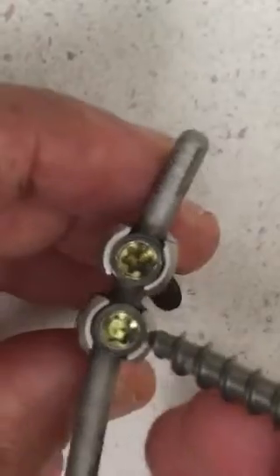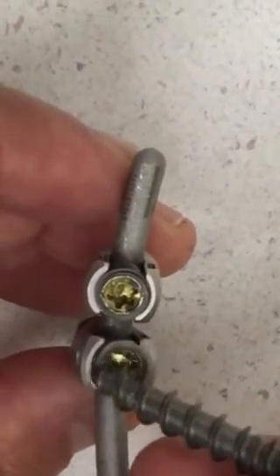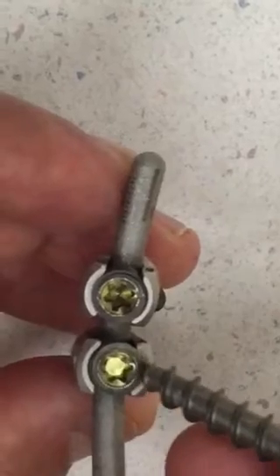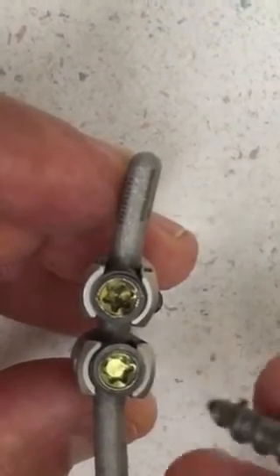The outside cap uses a six-star screwdriver, like a Star of David screwdriver. So you need a male screwdriver that looks like a Star of David. The inside of the screw uses the same exact screwdriver — a Star of David screw.